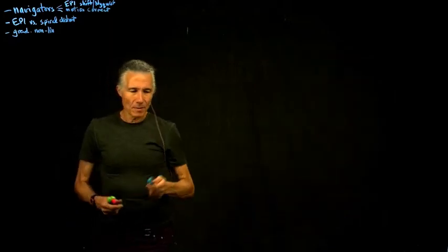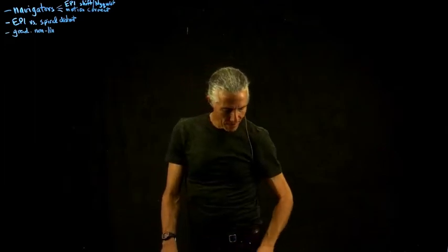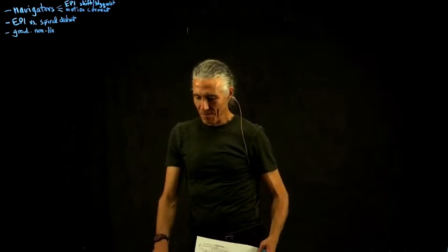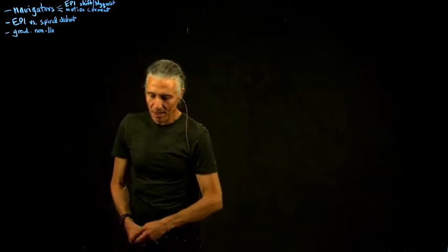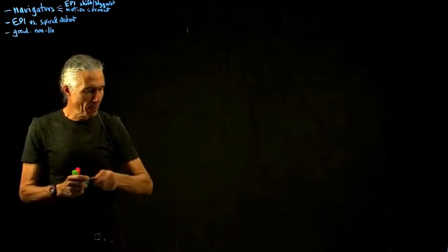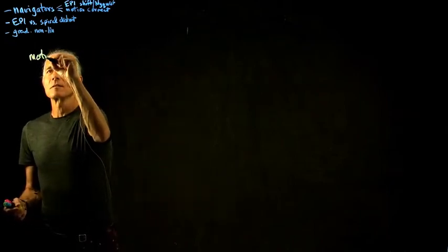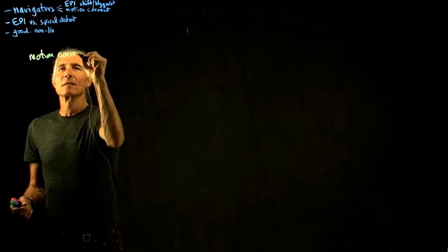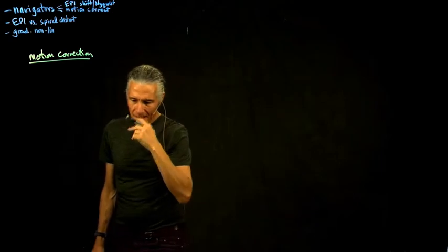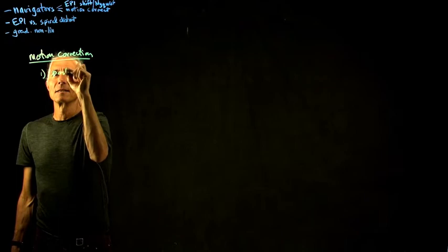So once again, the problem is we've got a problem with doing this really quickly. Let me briefly go over what I talked about on motion correction a couple lectures ago. For motion correction, obviously, the simplest thing if you're recording a lot of images is to just do it post hoc, just afterwards.